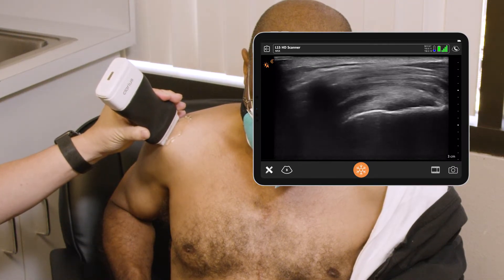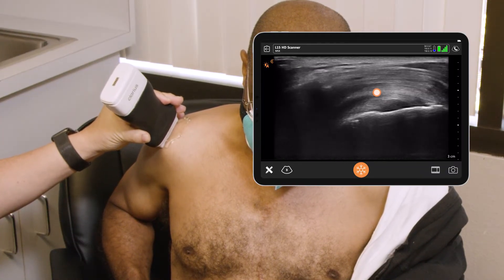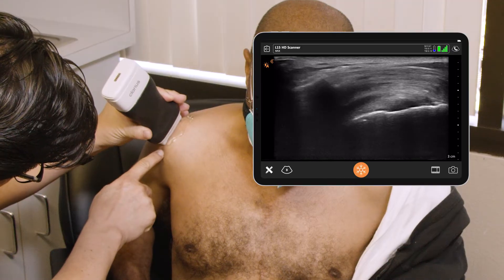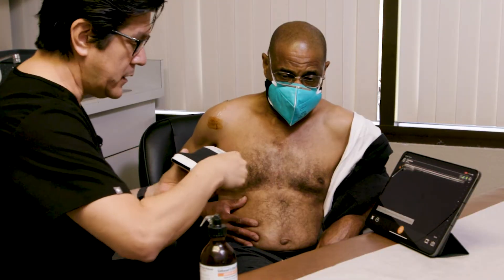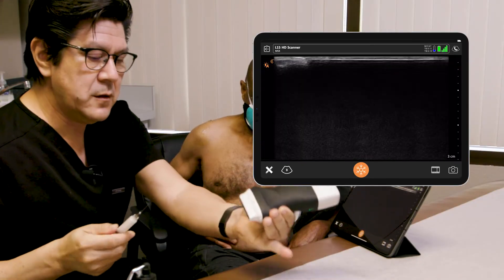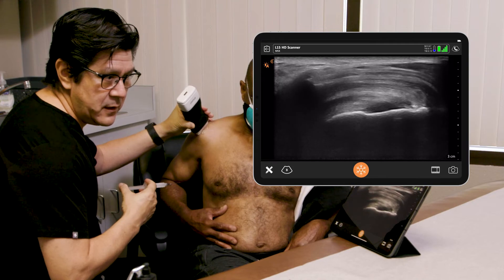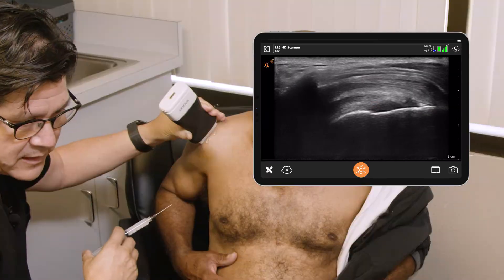Now it looks like we're ready to go. What we're looking for is that double white line of the fat — and there it is nicely right there. We're going to get right under that spot, and that will be our subacromial space — that's going to be our entry point. We'll clean it up and get it prepped. I'm going to use ethyl chloride to numb the area. One key point is making sure you're nice and perpendicular and square to the bone and tendon when doing your ultrasound, to make sure you're in the right spot with a good angle. And there's our best angle.